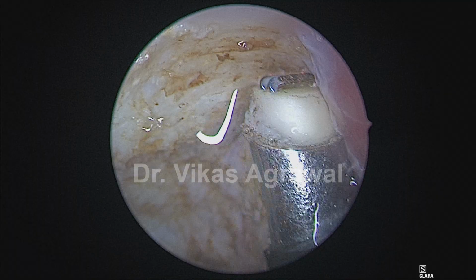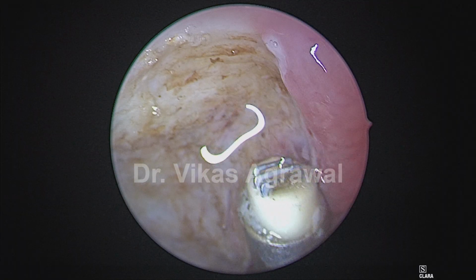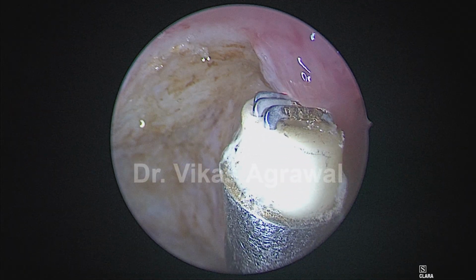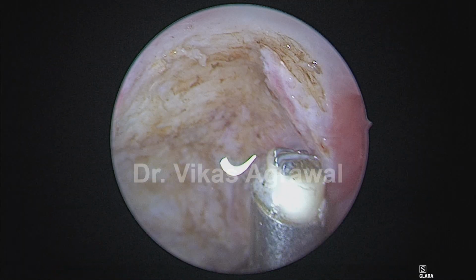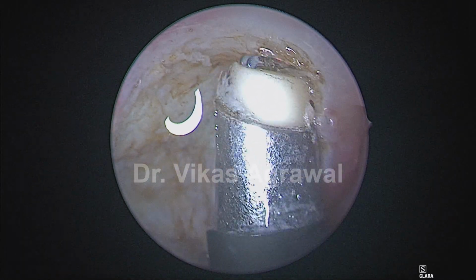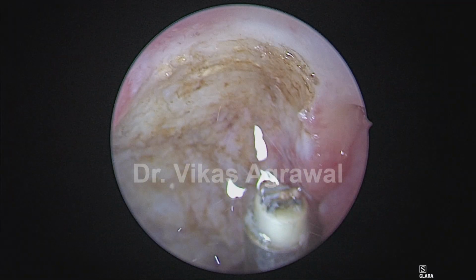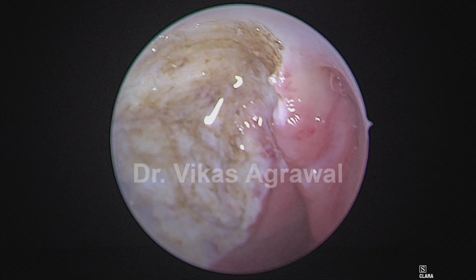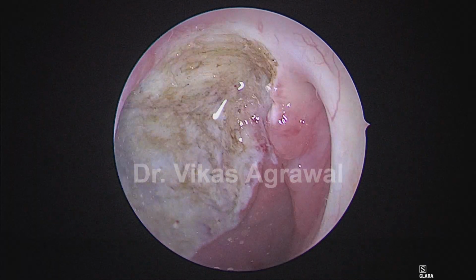So in this video, I have started from where most of the people will end their surgery, right? Because they believe that if you remove 70-80% of the tissue, the obstruction is gone. But obviously, the allergy is going to persist. The growth spurt of the child is still going to be there. The lymphoid growth spurt also. Let me just focus it a little better. All right. Thank you.